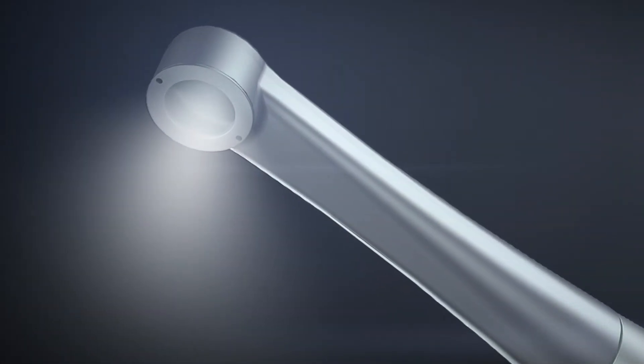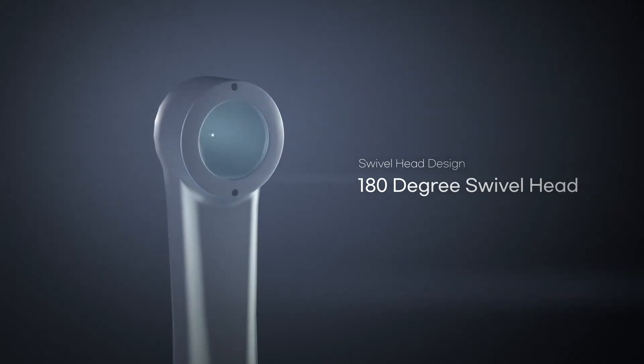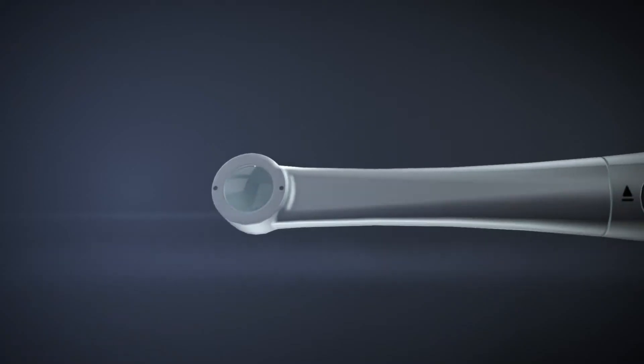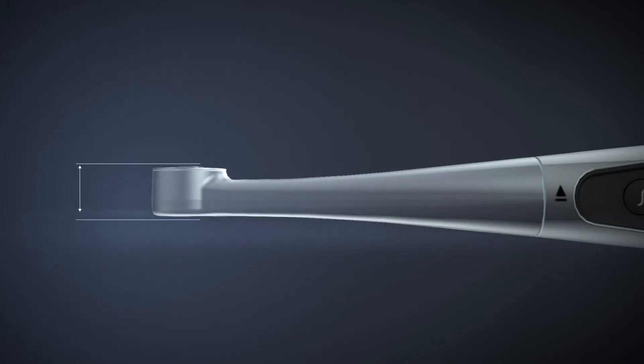Noblis has a 180-degree swivel head, allowing the user to direct the polymerized beam to where it needs to be for curing. The product has a 9mm thin head that makes it easy to reach the molar teeth deep inside the mouth.